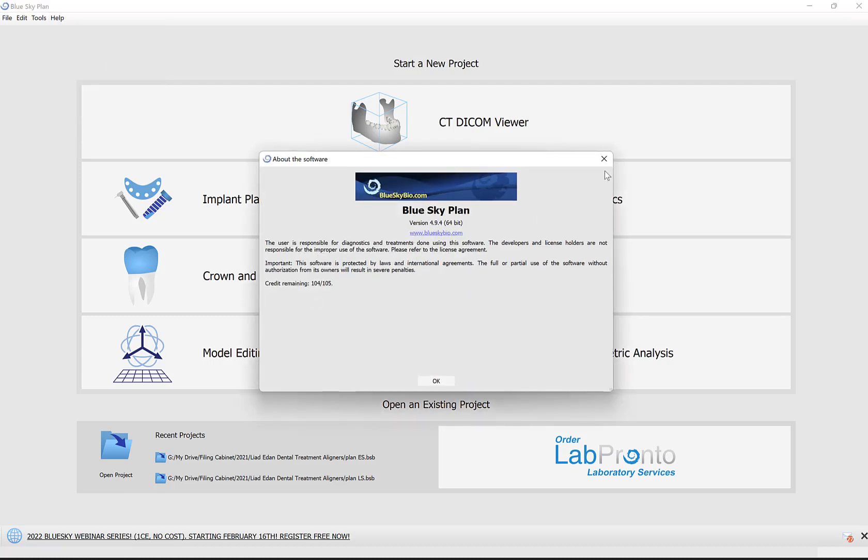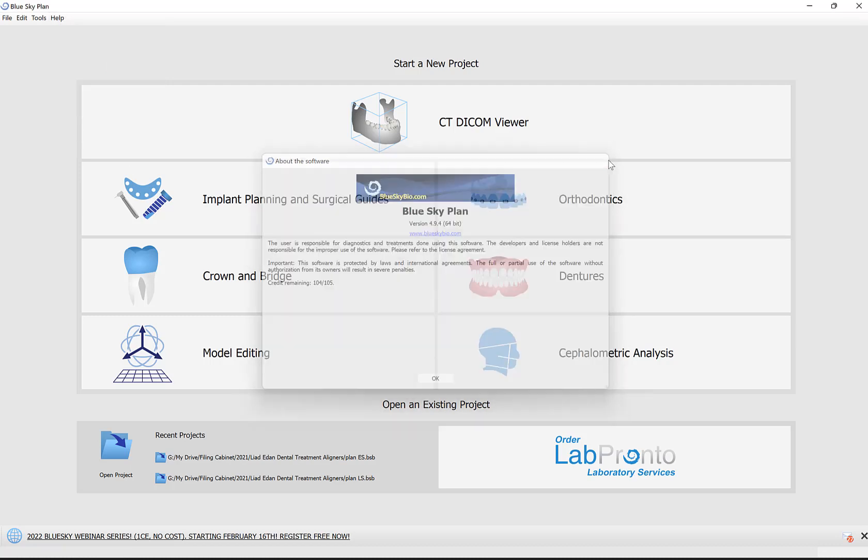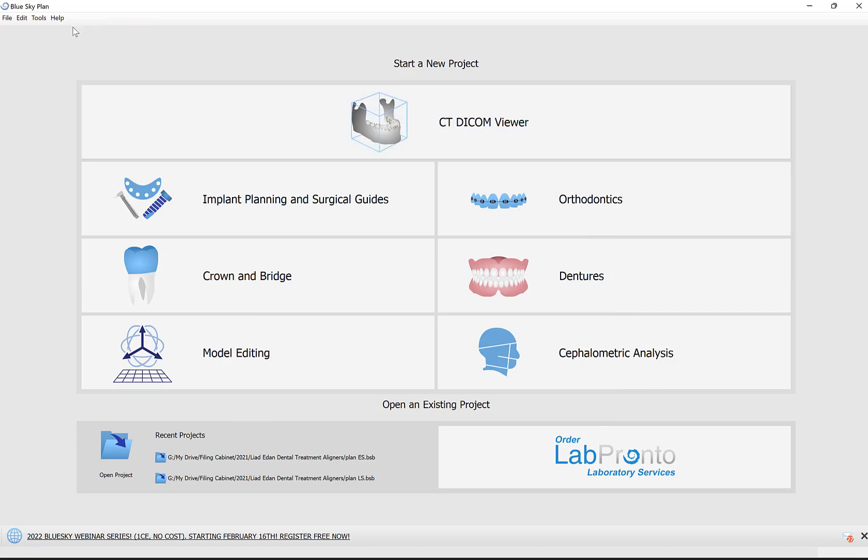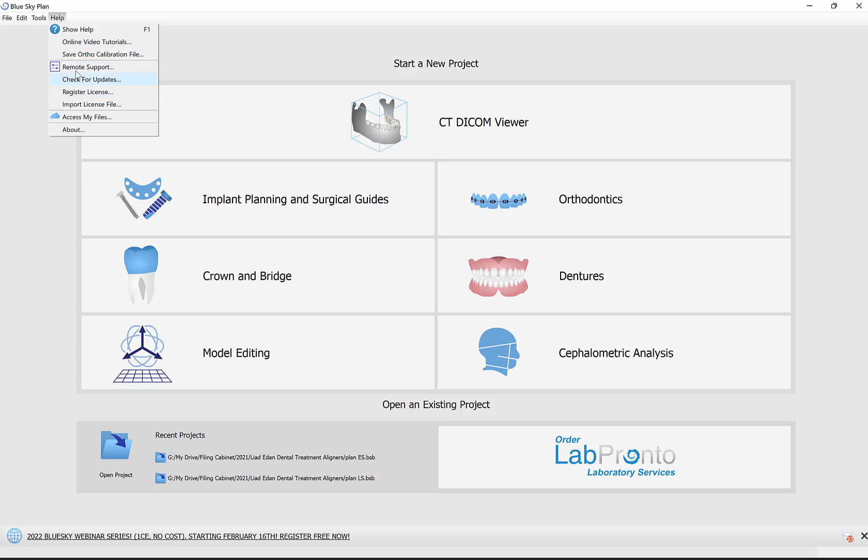If you're using a previous version, download from our website at blueskybio.com or blueskyplan.com. You can also simply go to Help, Check for Updates, and update directly from within the software.